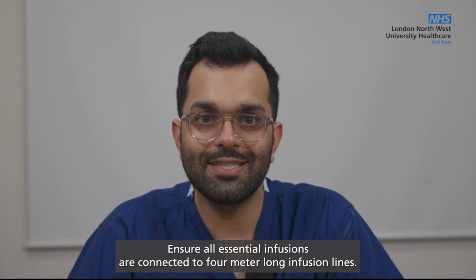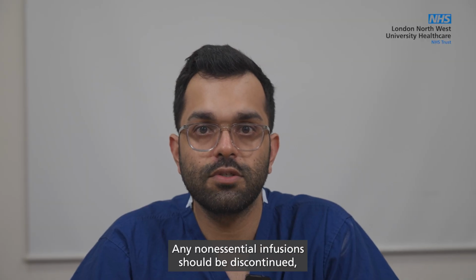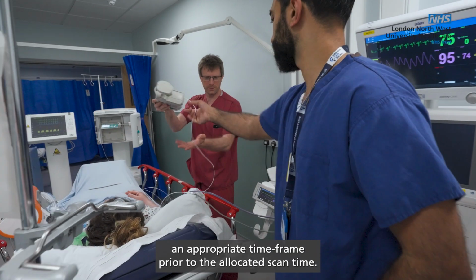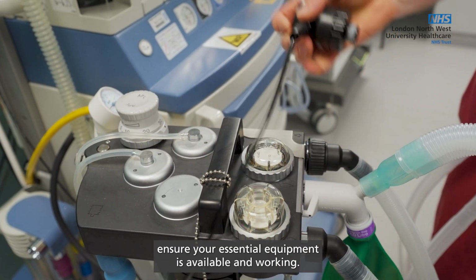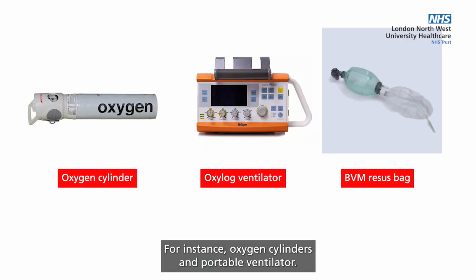Ensure all essential infusions are connected to 4-meter long infusion lines. Any non-essential infusions should be discontinued and any renal replacements stopped within an appropriate time frame prior to the allocated scan time. Give yourself a full hour. As with all transfers, ensure your essential equipment is available and working. For instance, oxygen cylinders and portable ventilator.